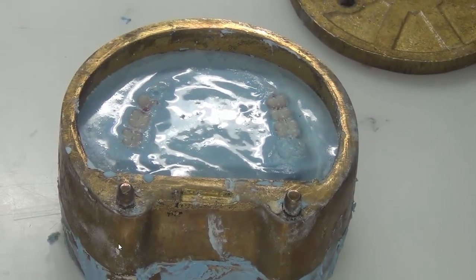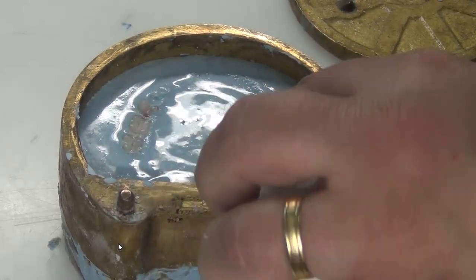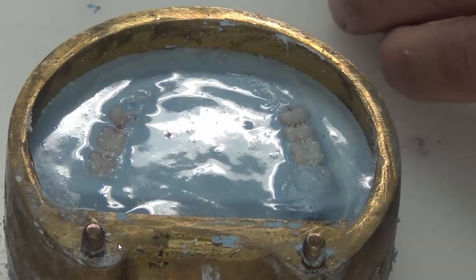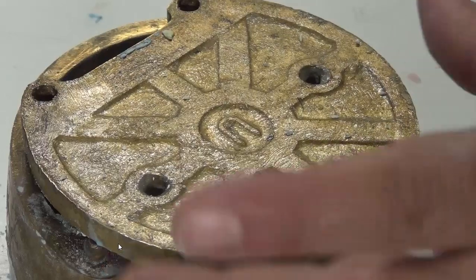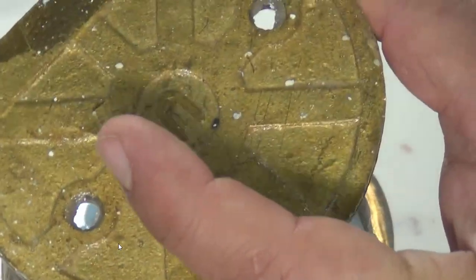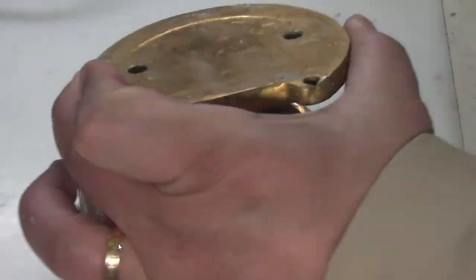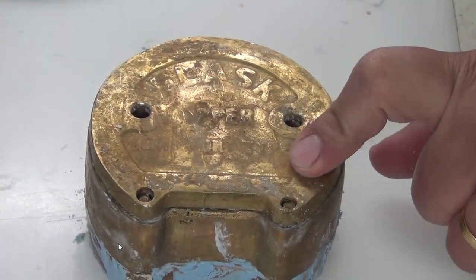Now we're going to do the next step. We need to make sure that we have clean rims after this step. Once more, the rims are clean. We have to have the upper lid ready. It is wiped with Vaseline, and the holes, which are vent holes, or escape holes, you'll see how they work in a moment. These are patent and open. And we make sure that the lid fits into location, okay? So we're checking the upper lid before we begin our work.